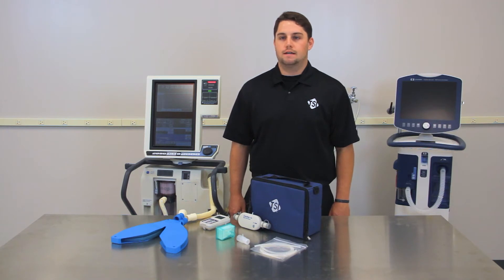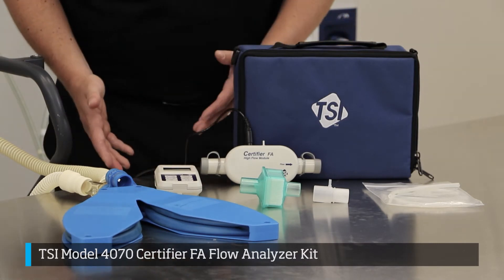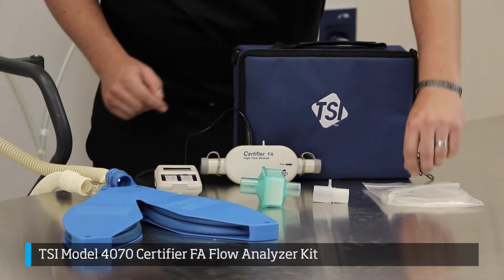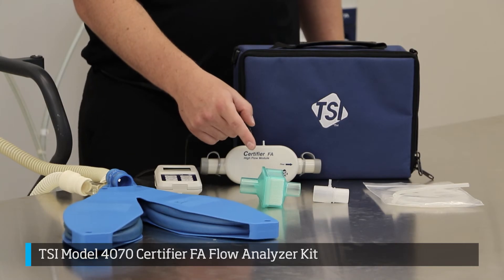From the Certifier FA kit, you will need the following components: the interface module, the flow module — and as you can see, we have already connected these — the airway pressure fitting with screen, a short piece of silicone tubing, and the high flow filter.